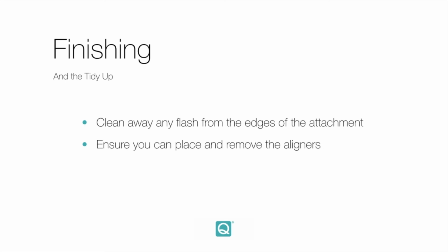You need to then double check that the patient can place and remove the aligners by themselves. Remember that the retention of these aligners dramatically increases as soon as we put attachments on the teeth. And it's a good idea to keep the attachment matrix with you or with the patient's lab work until they've reached the end of treatment.